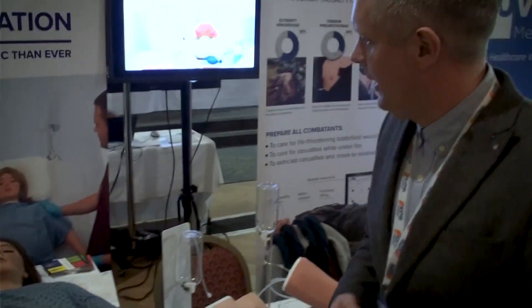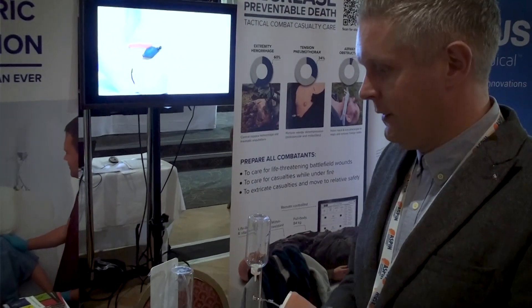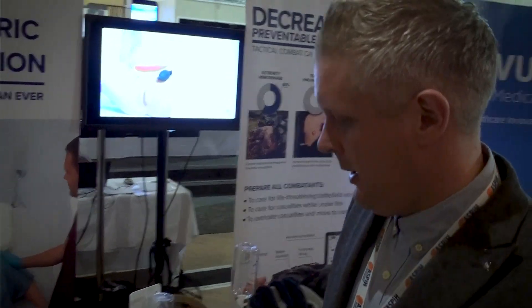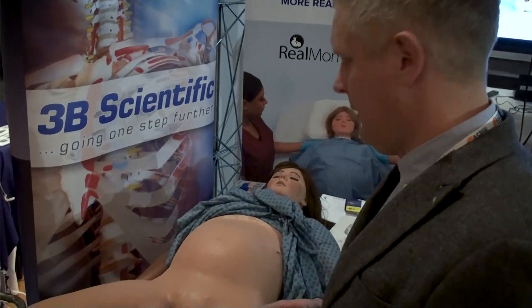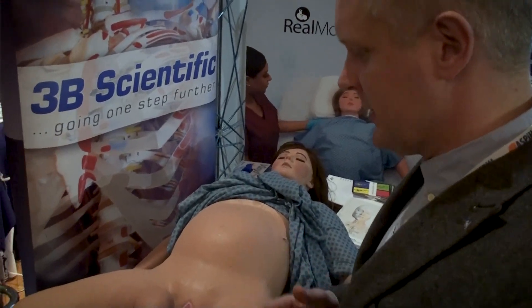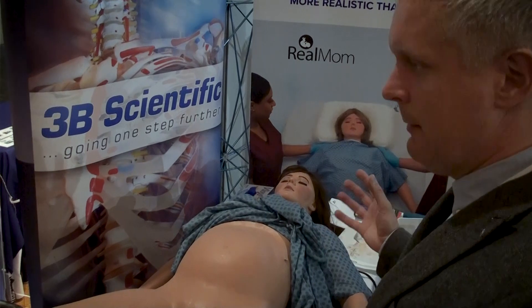Basically it's a full mannequin, made for a full vaginal birthing. The majority of the money, as far as I'm concerned, has been spent on the feel, the realism, the haptics, and how it actually works — as opposed to the 2.0 version which actually does a little bit more.